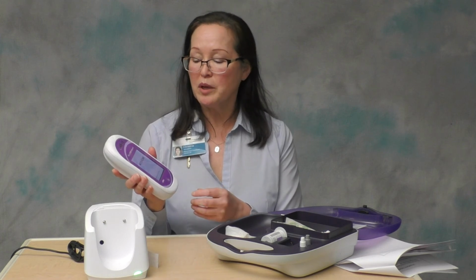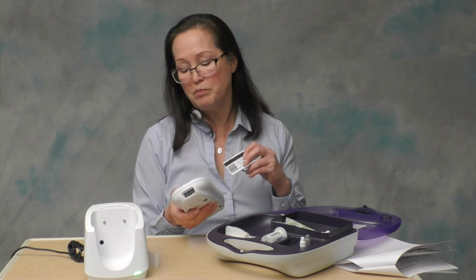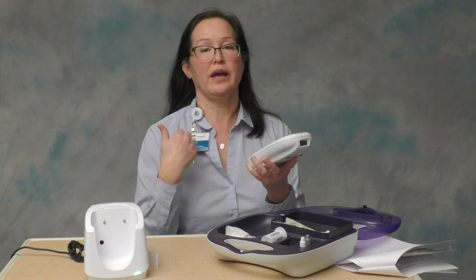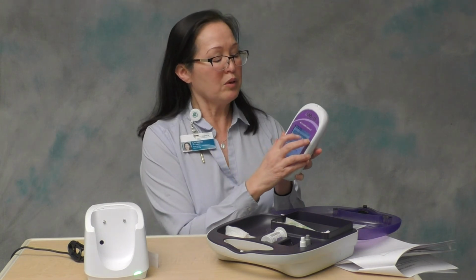You're going to turn the instrument on, and you are going to scan your badge. And you can also manually enter your badge ID if you memorize it. Say you're in an isolation room and you don't want to have to access your badge underneath your gown. If you memorize your badge ID, you can manually enter it. So now we're going to select patient test, and the first thing it asks for is patient ID.